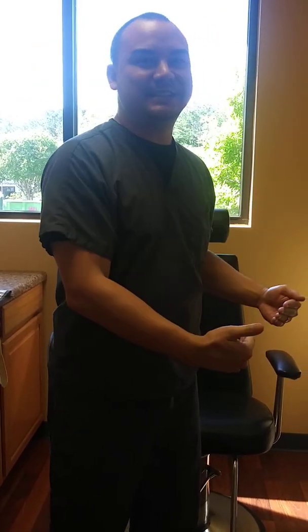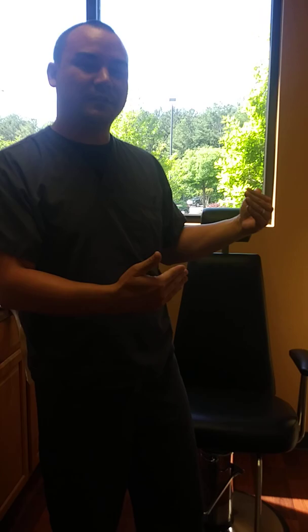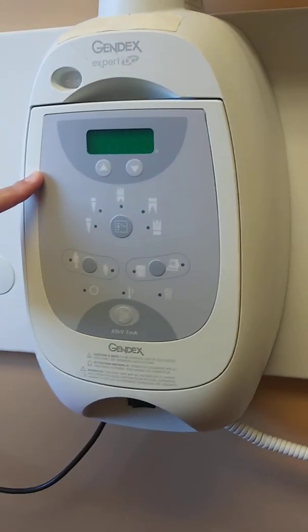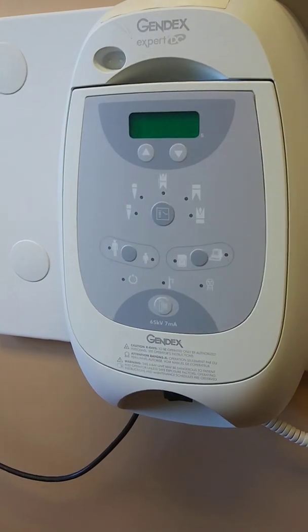I'm back again. I want to talk to you a little bit more about the control panels. In our previous video we talked about the very basic standard, more of an older style control panel. I want you to look at this one — it's more of a newer version of a control panel for a wall mounted radiographic machine.